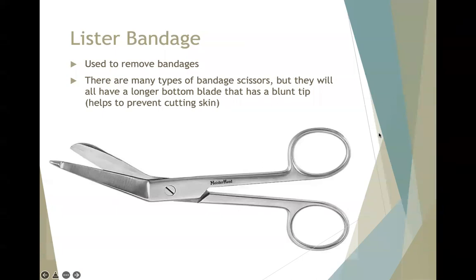All right, my next scissors that I'm going to look at here, these are Lister bandage removal scissors. Now, these scissors do not have to be sterilized in the autoclave. They can just be cleaned and disinfected. As you can imagine, when we are removing bandages, these bandages are not going to be sterile. They're going to be kept on the patient for a few days at a time. So they're going to be dirtied up anyways, as we're removing to place a new bandage. So these don't have to go through the autoclave. They don't have to be sterile, nothing like that. We use them in what we would say dirty procedures.